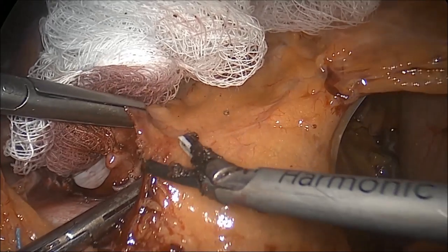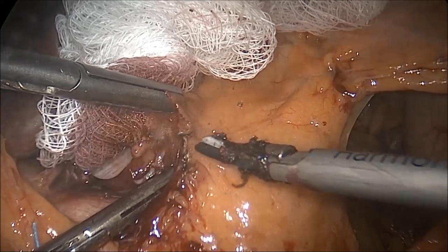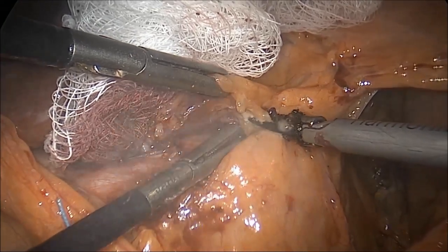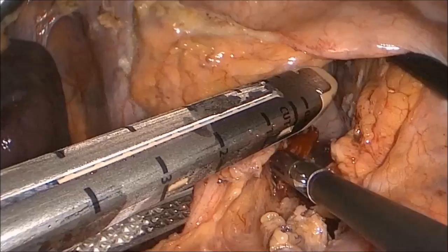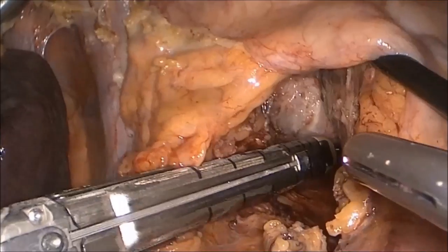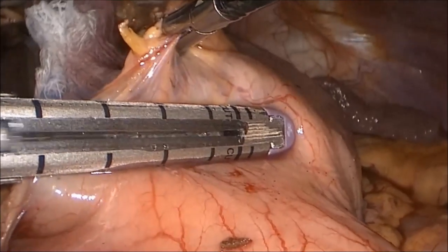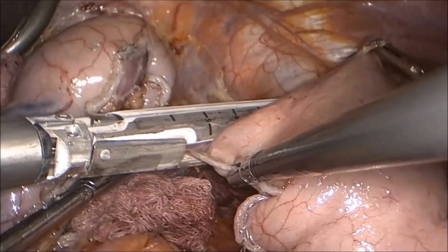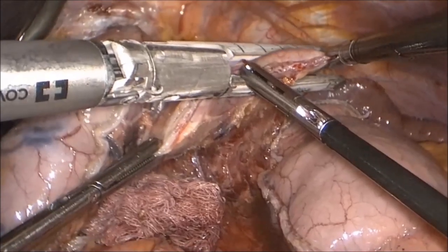The stomach is then retracted anteriorly, and the left gastric vessels are dissected close to the origin to maximize lymphadenectomy. The left gastric vessels are then ligated with a vascular load endo-GIA stapler. Once the stomach and distal esophagus are completely mobilized, a 4-centimeter-wide conduit is created using a series of medium to thick tissue load endo-GIA staplers along the stomach parallel to the greater curvature.